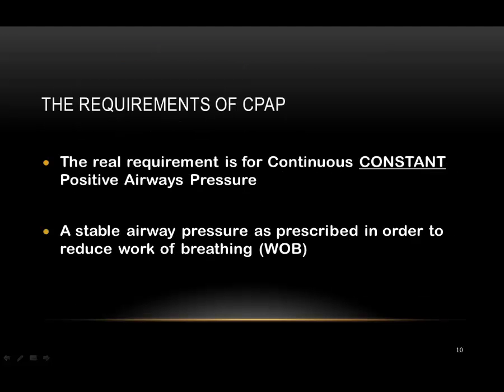The real requirement is for continuous, constant positive airway pressure with minimal fluctuations in system pressure between inspiration and expiration. This constant pressure will help reduce the patient work of breathing, which is important since it reduces the resistance to airflow that is present in lung disease. This holds the alveoli at more inflated levels. It is easier to fill the inflated alveoli and hence less work of breathing.